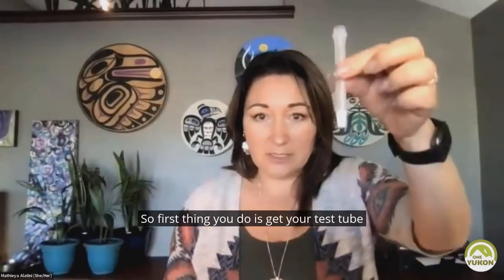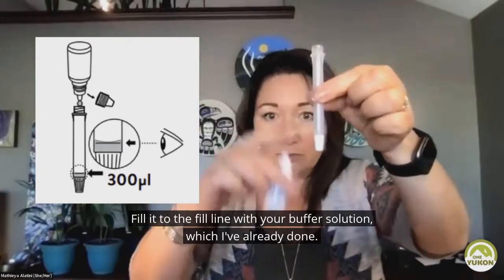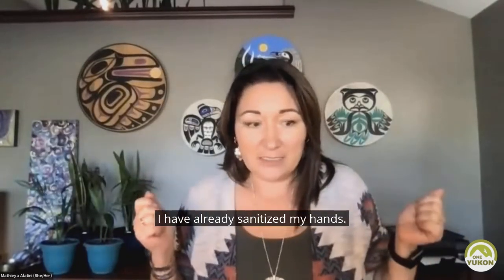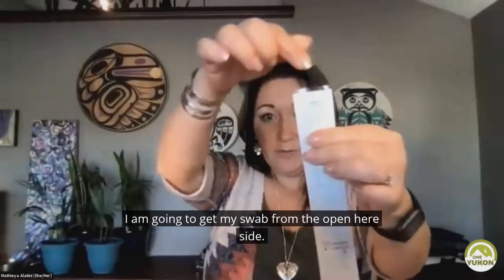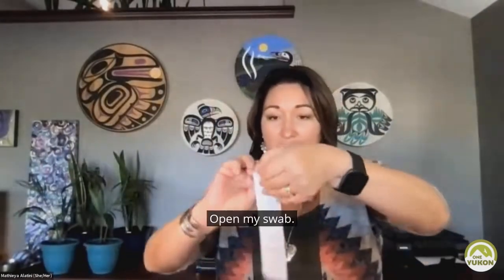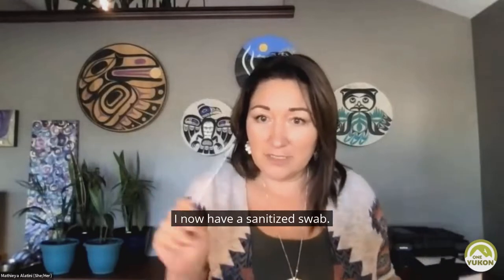So first thing you do is get your test tube. You fill it to the fill line with your buffer solution, which I've already done. I have already sanitized my hands. I'm going to blow my nose. I am going to get my swab from the open here side. Open my swab. I now have a sanitized swab.